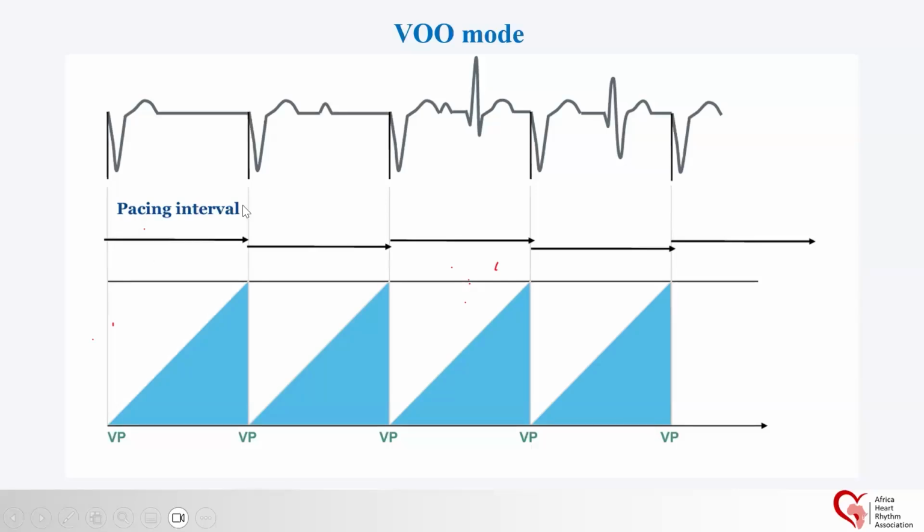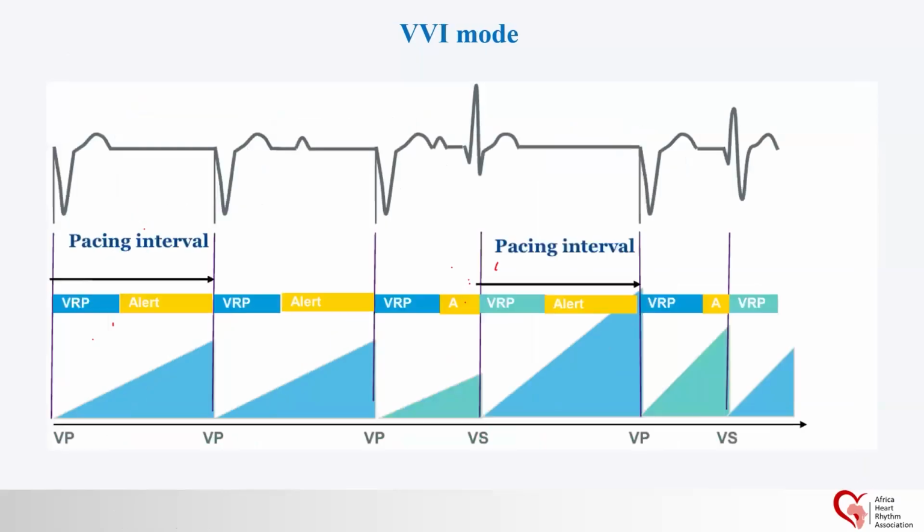Dès qu'elle termine l'intervalle, elle va restimuler. Le compteur, dès qu'il atteint la fréquence de stimulation, elle va restimuler. Même si elle détecte quelque chose, elle ne va pas le prendre en considération, parce que c'est un mode asynchrone. La base de fonctionnement de ce mode, c'est le compteur, c'est-à-dire la fréquence de base qu'on a programmée.